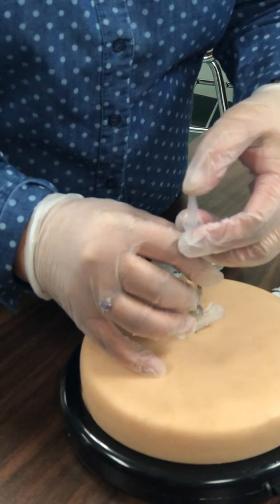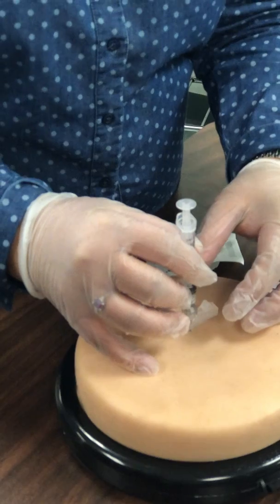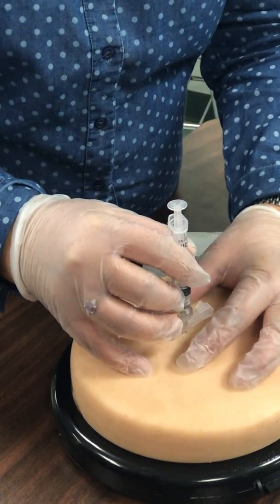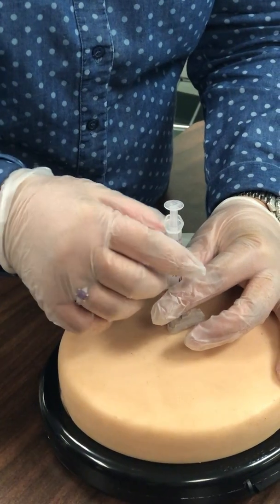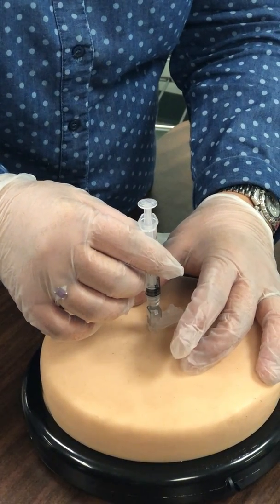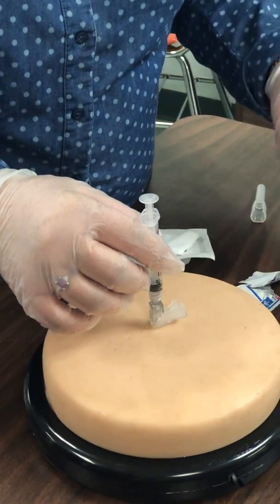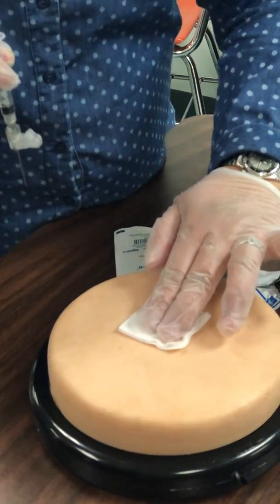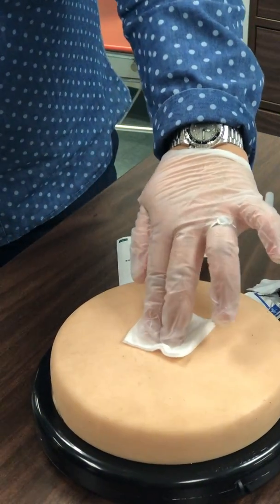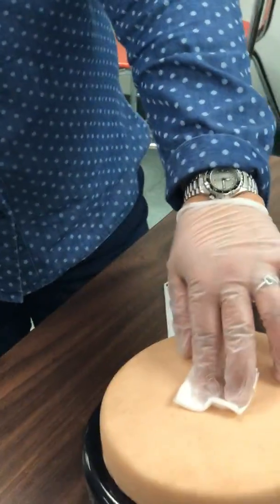Pushing the medicine is kind of, we do it slowly. All right. Or you can let go of the spread and secure it over here and then push it with your other hand. So there are different ways, as long as you don't move your syringe, that's fine. All right. But that's it, right? And then we cover, we press. Then we will check if it's still bleeding, about 2 to 3 seconds. And then if it's not bleeding, then we're fine now.